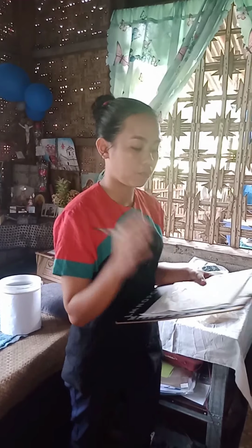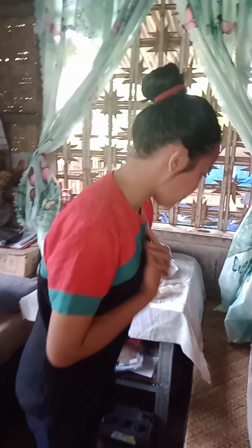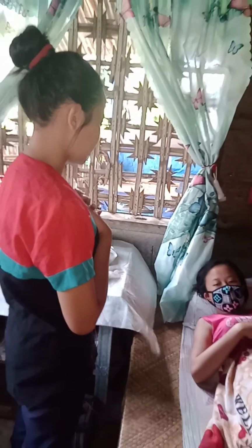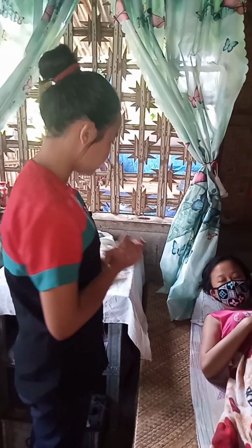Then after that, it is the time to explain the procedure to the client and instruct the client not to touch the wound area and any sterile supply. But before that, we need to first greet the patient, and then explain the procedure. So good afternoon, ma'am. I am your CNA today. I am Mary Jan Valeta Katubig. So for today, ma'am, we would be doing wound care.